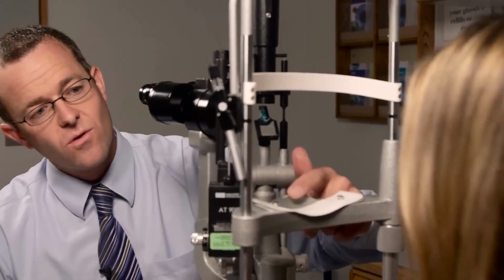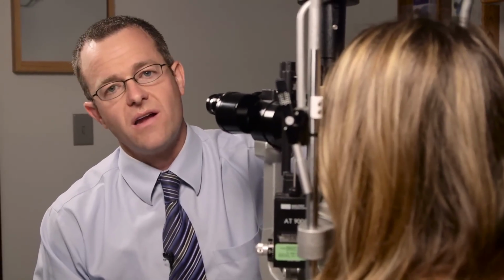So you ask them to please come forward here, chin down in here, forehead up against the headrest. It's important they try to keep their head up against the headrest.